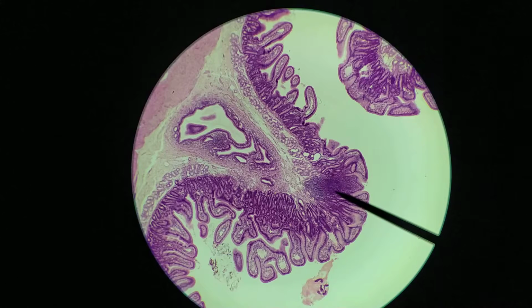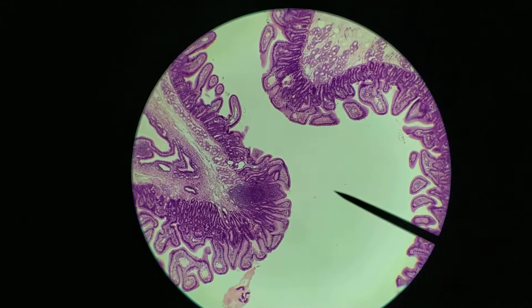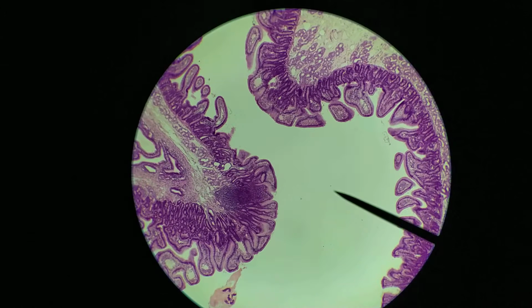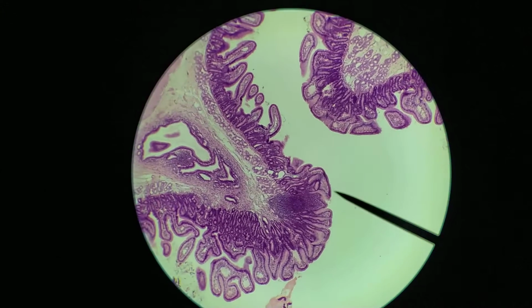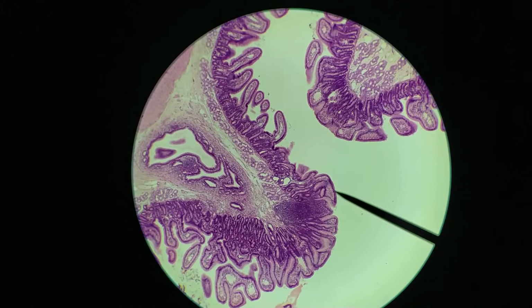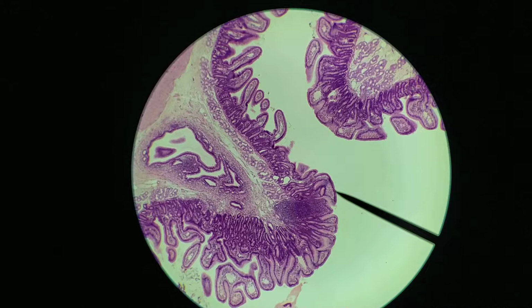Now this lymphatic tissue is necessary because what you have in the lumen is a region that is going to be in contact with the outside world, which means that if there's any pathogen that's coming through, it'll be coming in from the lumen. And so what we have here is a simple columnar epithelium, which is not very difficult to penetrate, and so you need to have some sort of protective mechanism in place just underneath this epithelium.